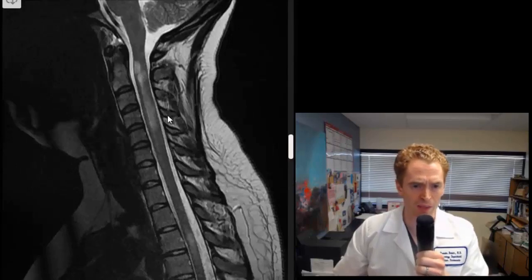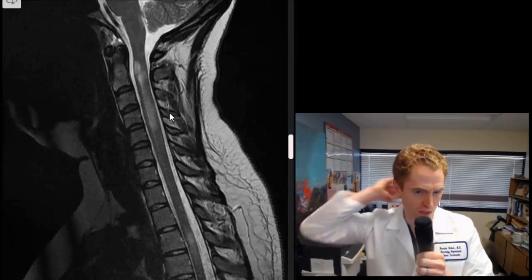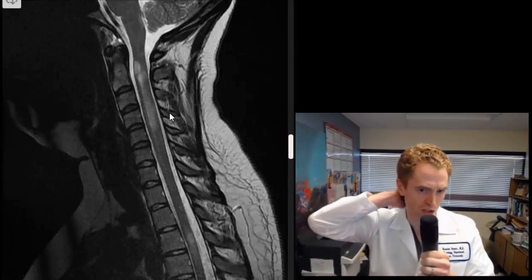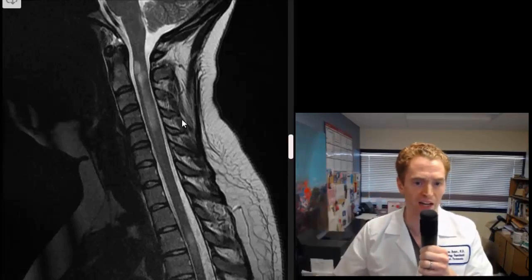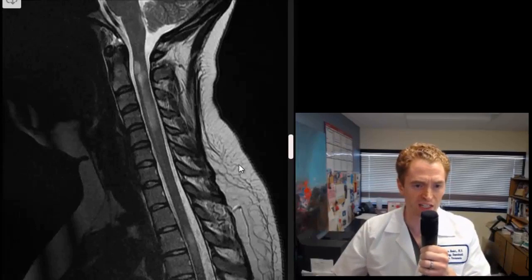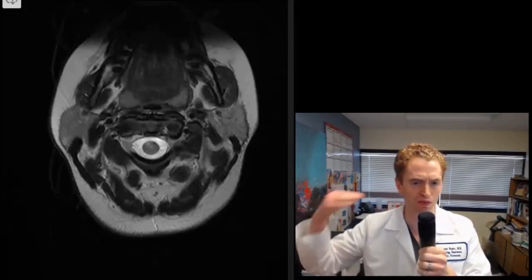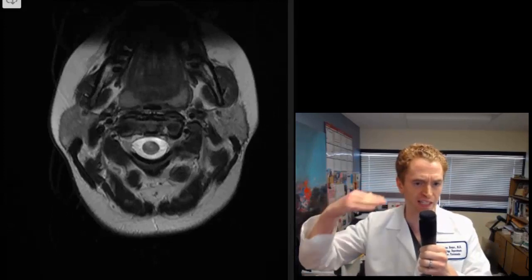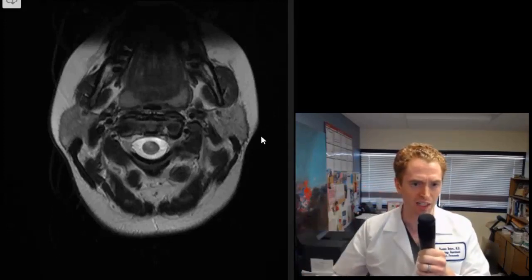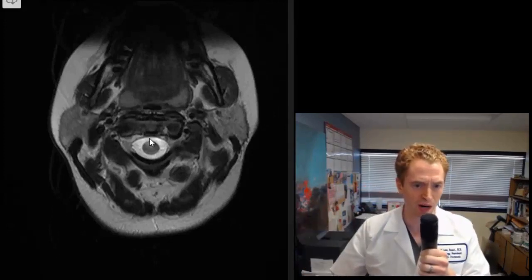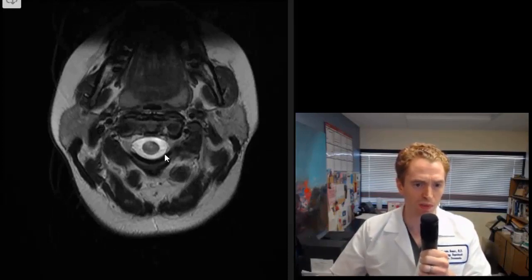Just to look at some other structures, these are the spinous processes extending backwards — you can actually touch those bony prominences on the back of your neck. And here is the fatty subcutaneous tissue. Now we're going to look in cross sections — slices through the neck. Here you can see the spinal cord surrounded by normal cerebrospinal fluid, which is normally bright.